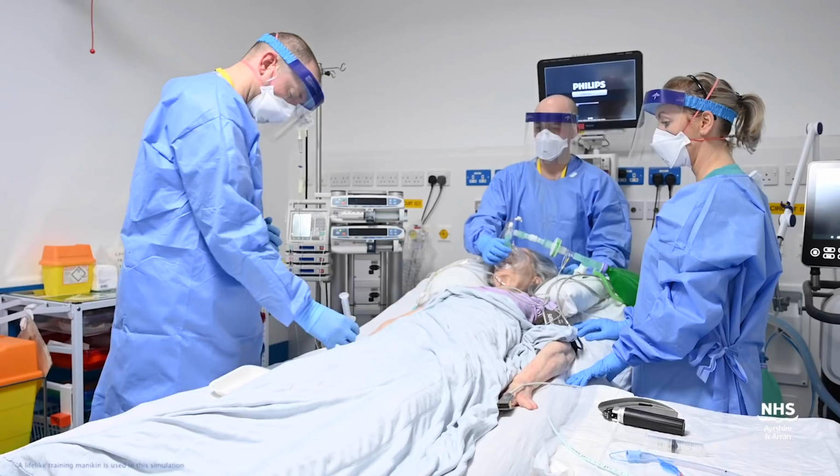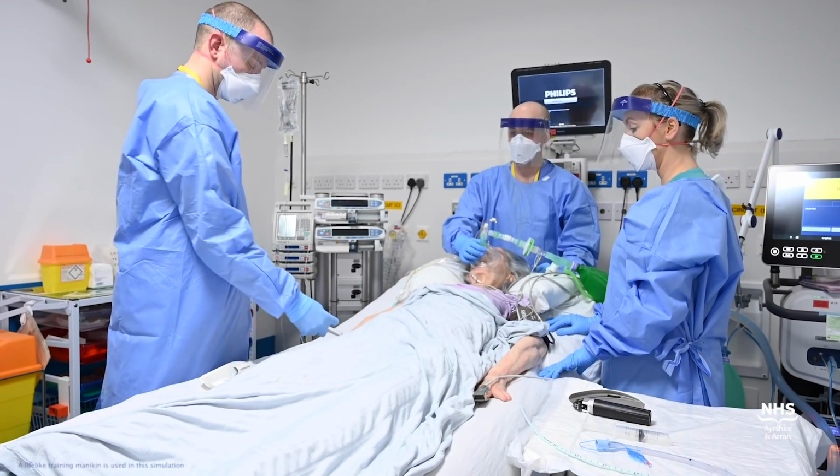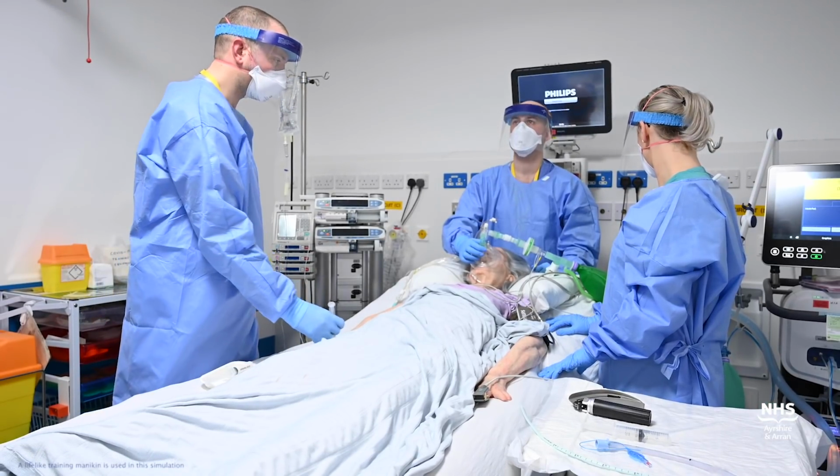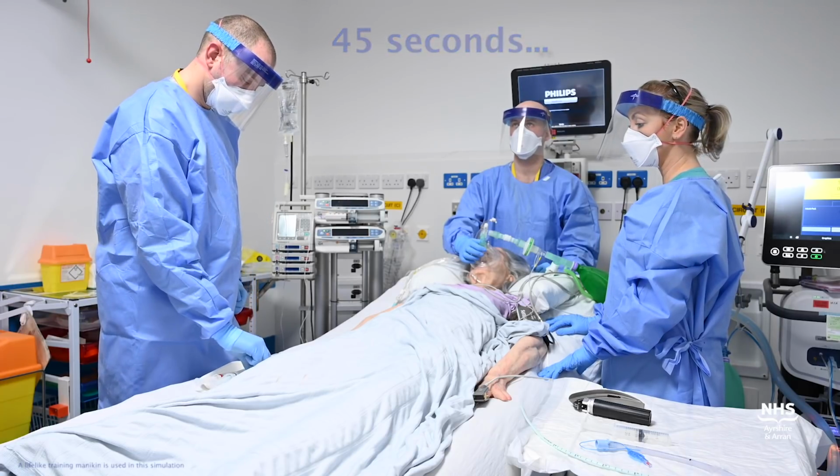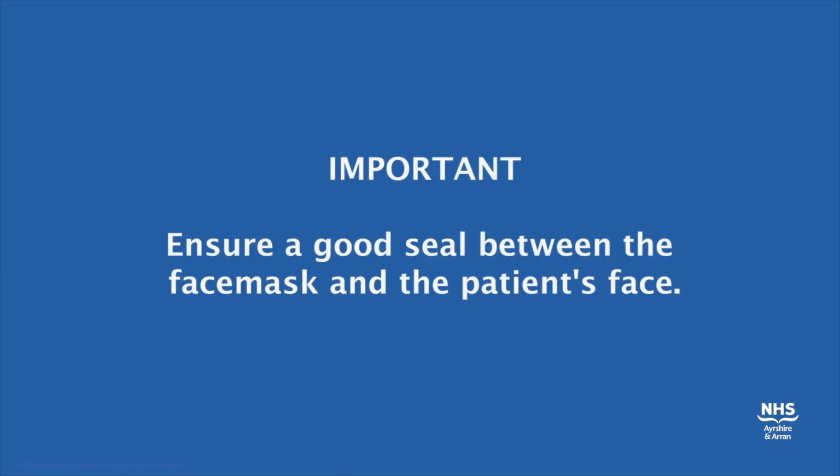aerosol generating procedure. Following administration of a muscle relaxant agent, wait for 45 seconds prior to attempting intubation. During this time, you should avoid bag mask ventilation if possible, and ensure a good seal between the face mask and the patient's face to reduce the risk of aerosolization.